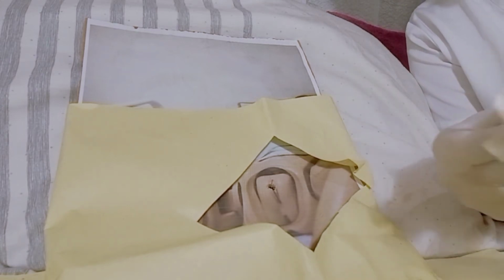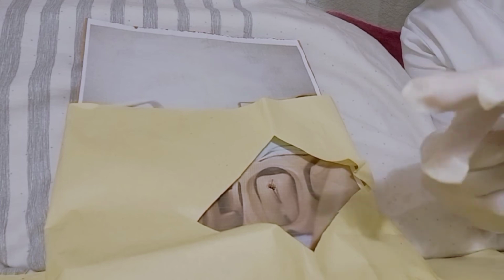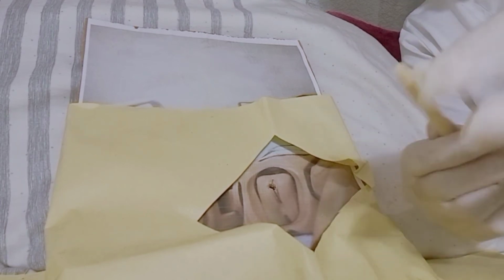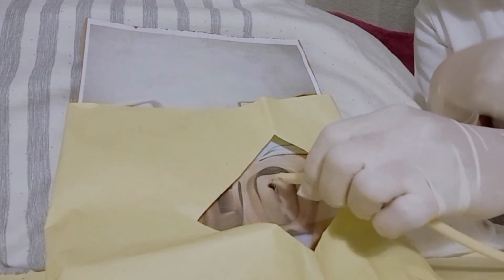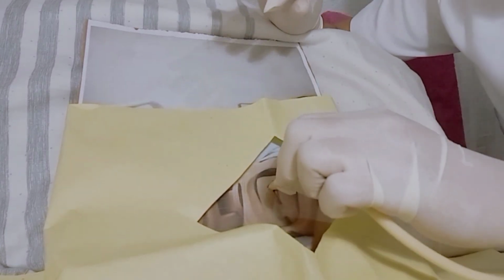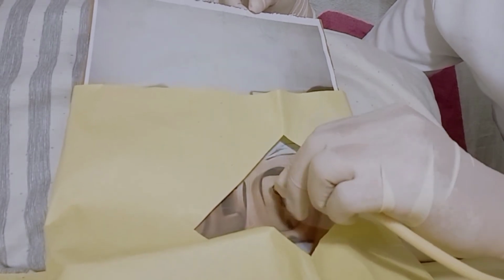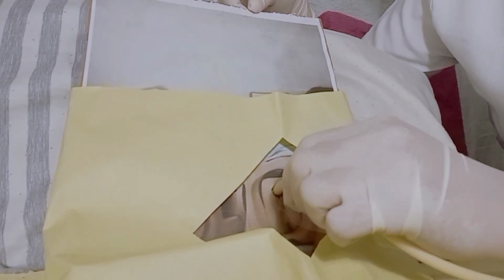You should apply 1 to 2 inches of water-based lubricant jelly or KY jelly before you insert, while holding the labia majora apart with the non-dominant hand until the catheter is inserted.